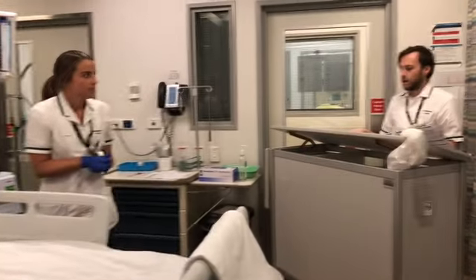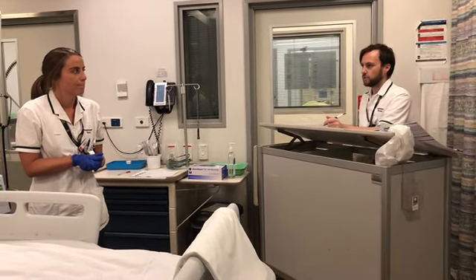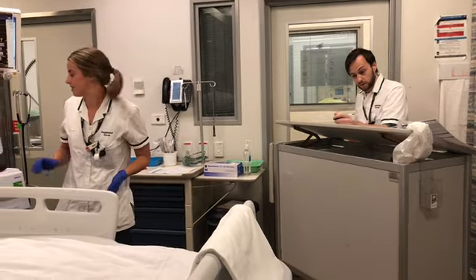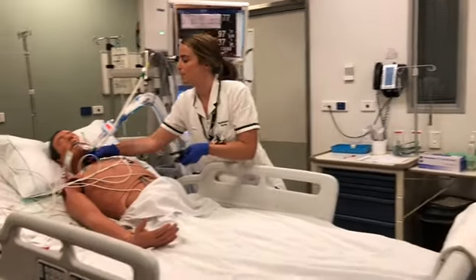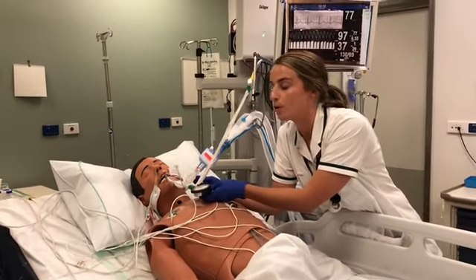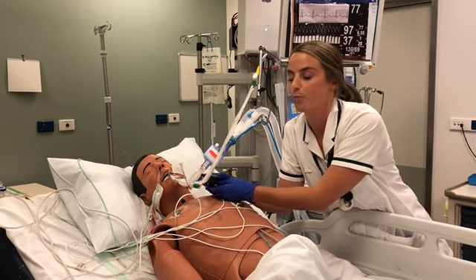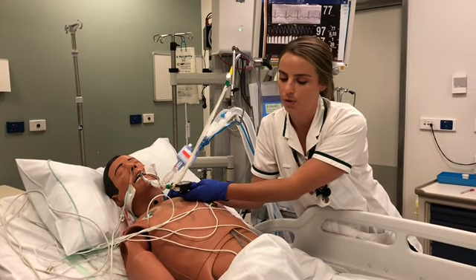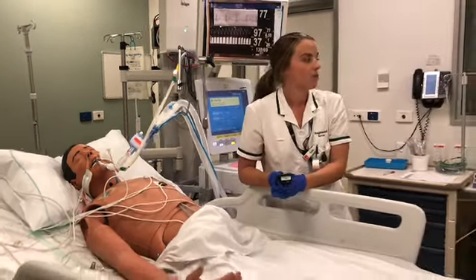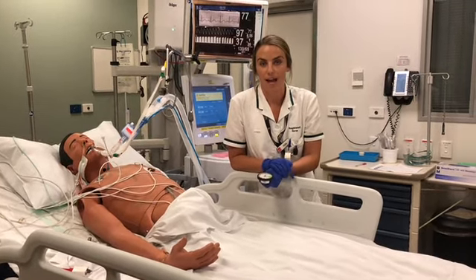Happy with our patient assessment there, Michael? I am happy. Are you happy to tell me what that cuff pressure was in the time that I was not here? Thanks for the prompting. I missed that. So our tube is size 7. We're 20 at the teeth. Cuff pressure 22. Perfect. Lovely. Once we're both happy, that brings us to the end of section A.